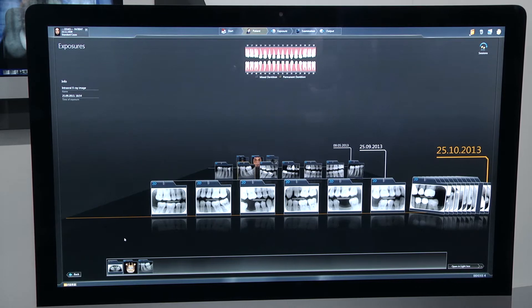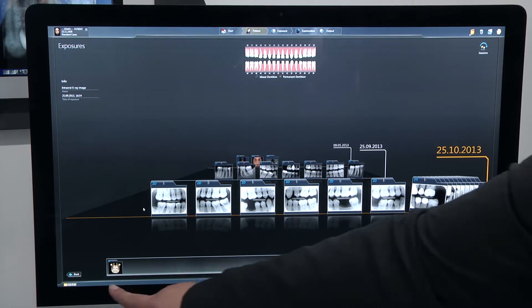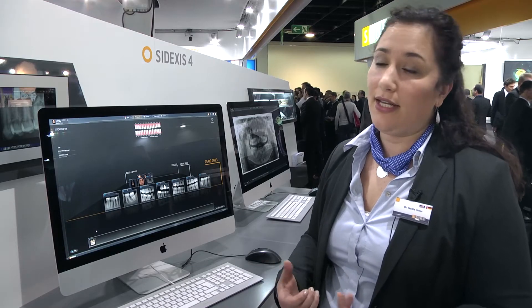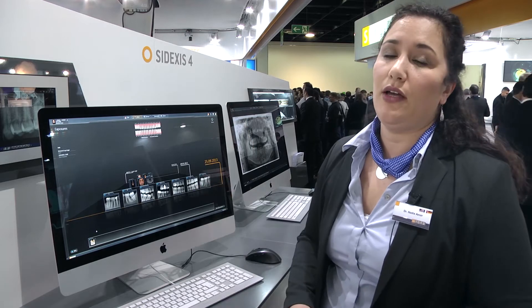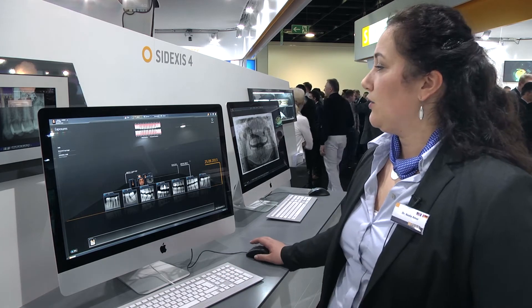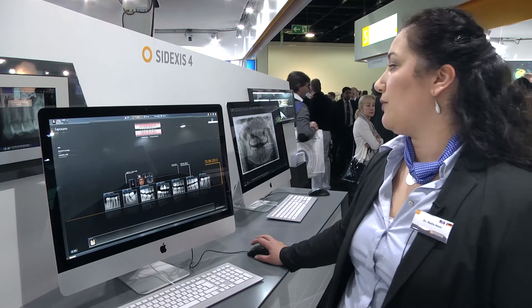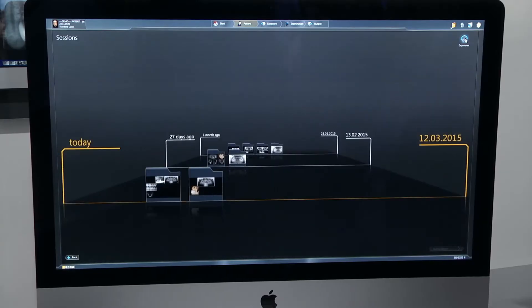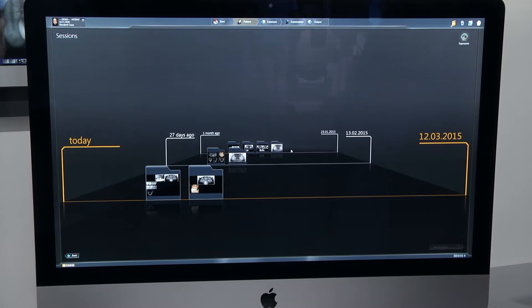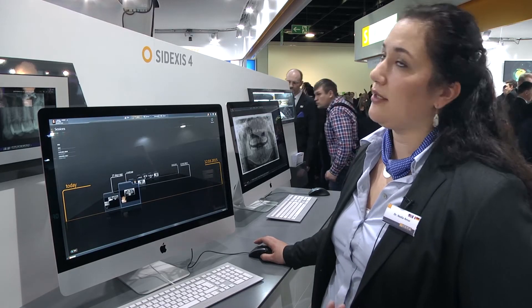If I leave out the 2D images and only have one 3D scan selected, the next step is automatically selected as open in 3D examination. If you have done your selection before already and would just like to continue with that selection of images, you can do that as well very quickly. You just go to the upper right and swap the timeline, and now you're in the session view. You can see all the different sessions saved and just select one to continue where you last stopped with that particular patient.